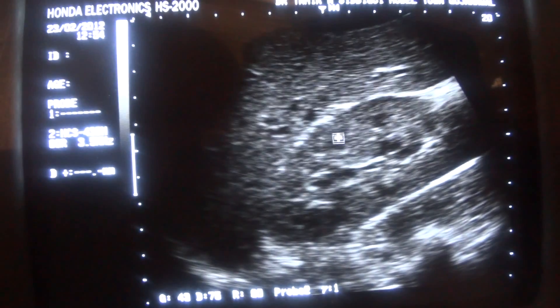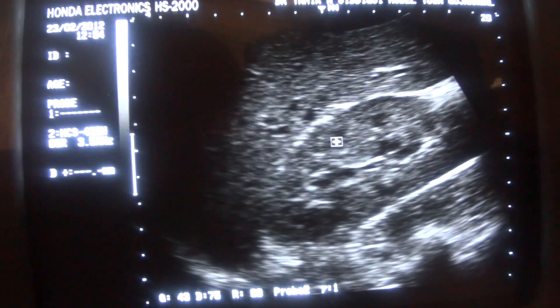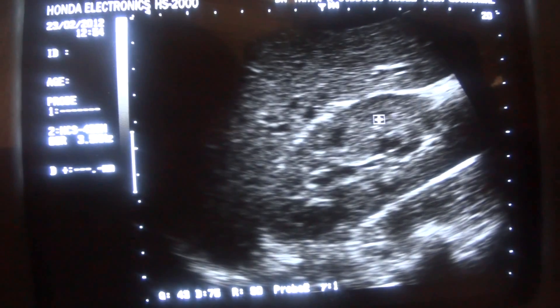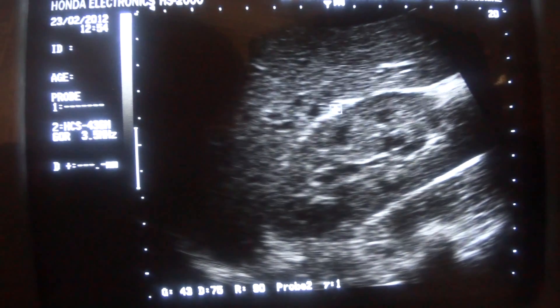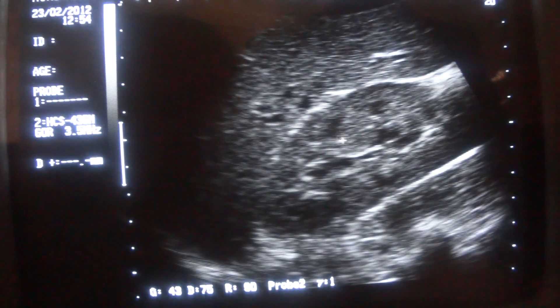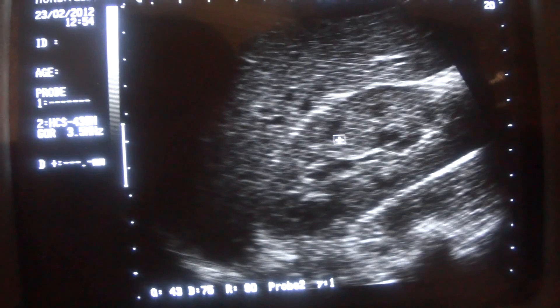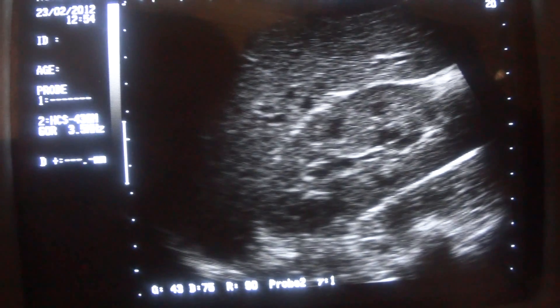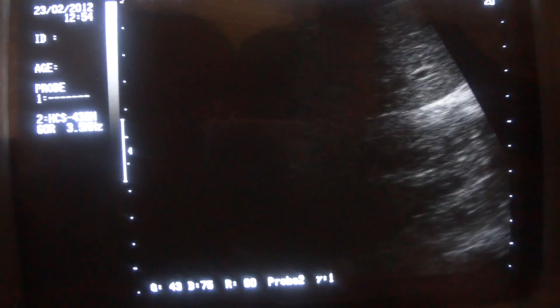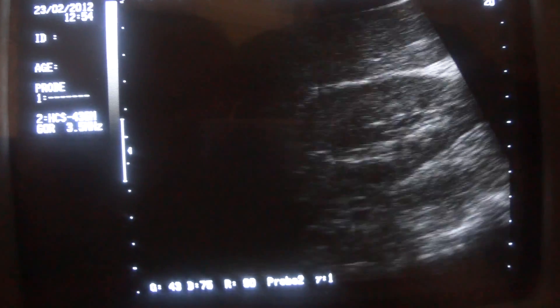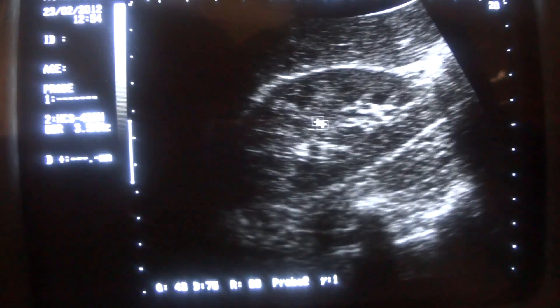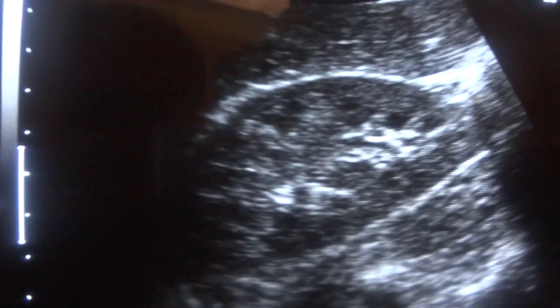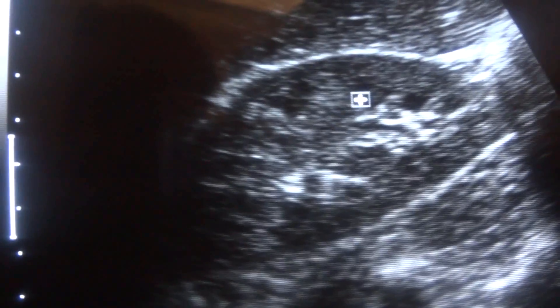So if you can see the medulla and the pyramids within it — this is the pyramid and this is the cortex — it means that the corticomedullary distinction is intact. This is the lower pole. This is the pyramid, and this black tiny cystic area — they are really triangular.